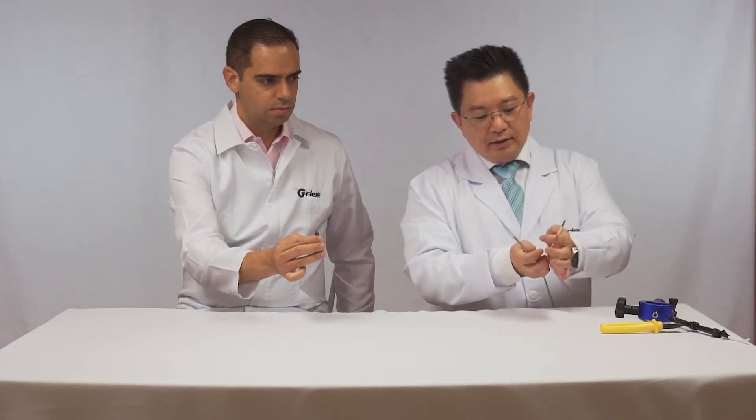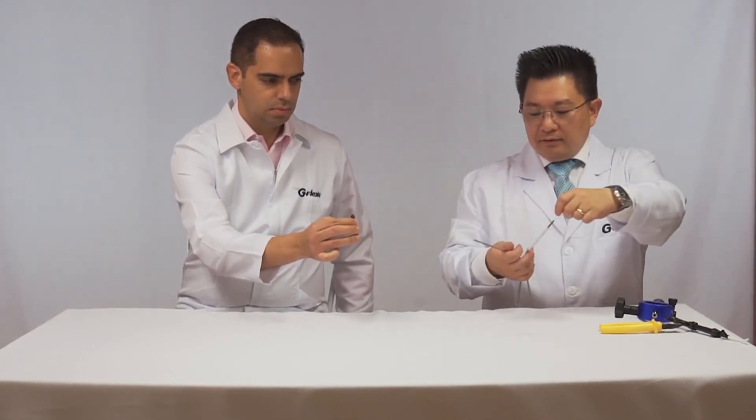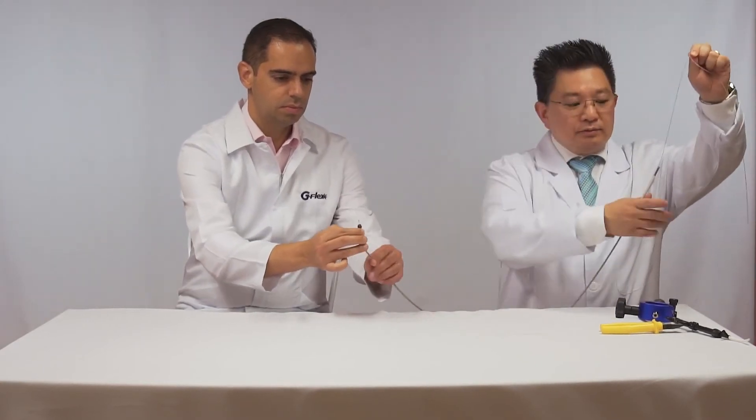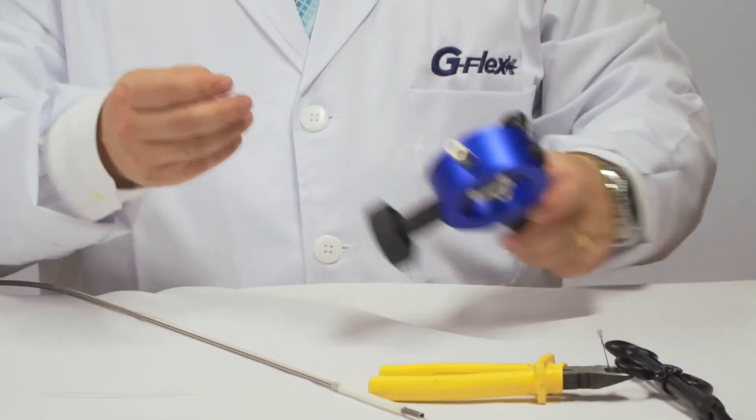In this moment, the coiled sheath penetrates the mouth of the patient and reaches the stone. Now it's time to use the handle.